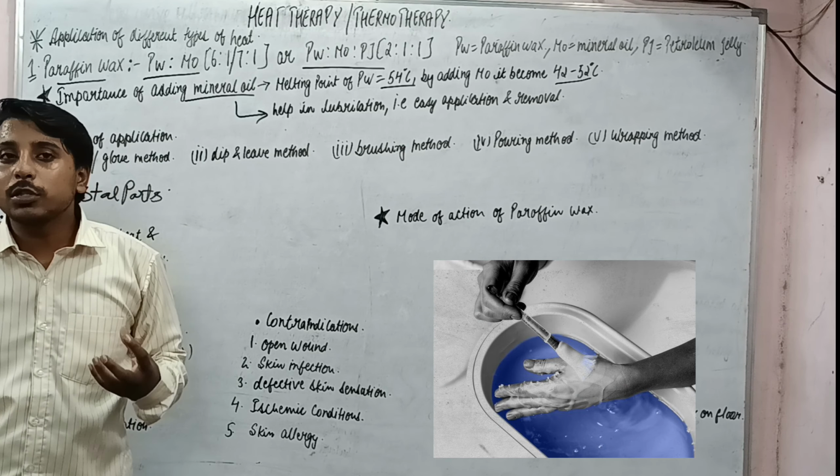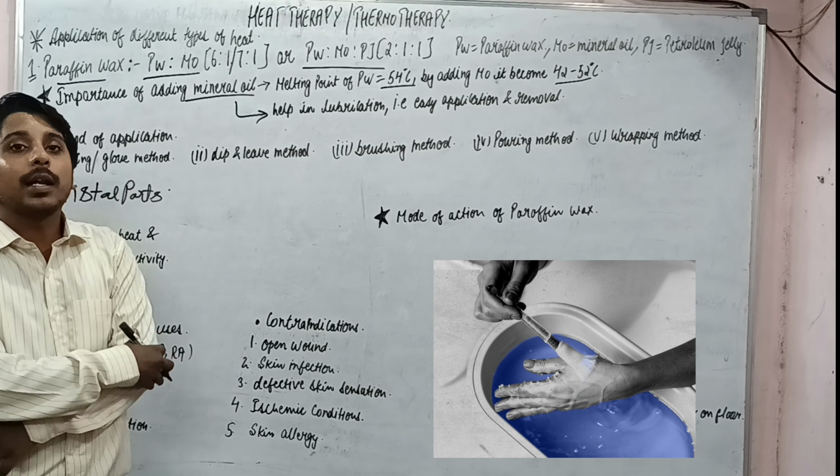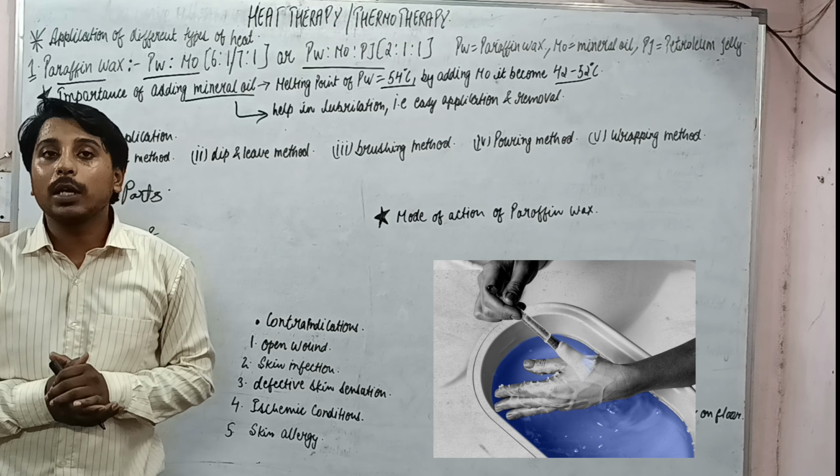Brushing method. It is used in the proximal parts such as shoulder and knees where dipping is not reliable.